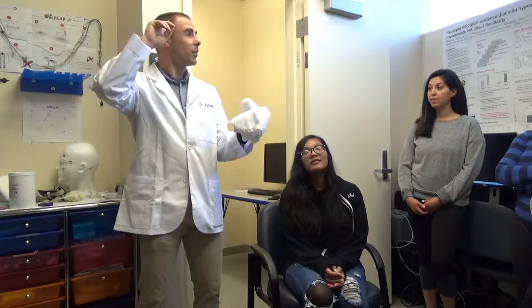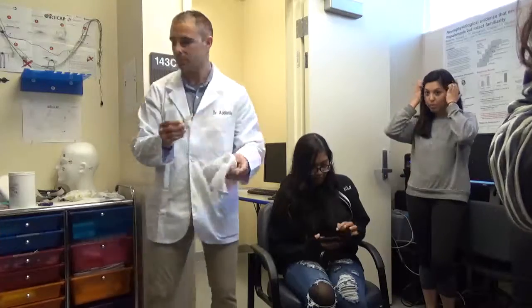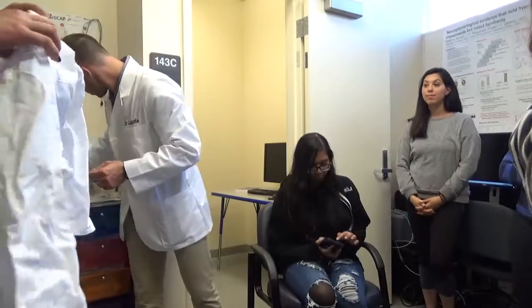And who wants to be some of our first research assistants? Anybody want to help? A little help? Okay, you got one? Okay. I'm sorry? Okay, so Summer, would you be so kind as to look in the second drawer up from the floor, and you can throw out a couple extra lab coats for some of our helpers, and we clean this off. And there's different sizes, so just see what works.